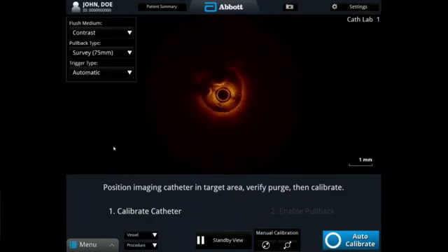We're going to do a run now. I'll do it right now. I don't think we did it. Yeah, we'll do it. That was the old run. So just move your distal and proximal markers either side of the lesion, and then just tell us what the MLA is here. Because I think the MLA was at the region of the nodule, or the multiple nodules.